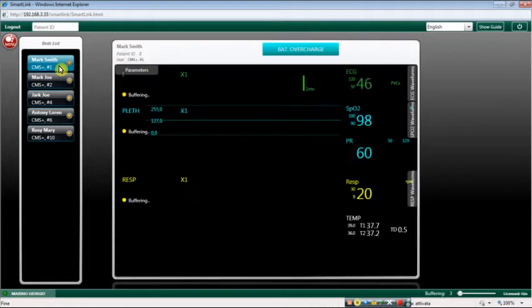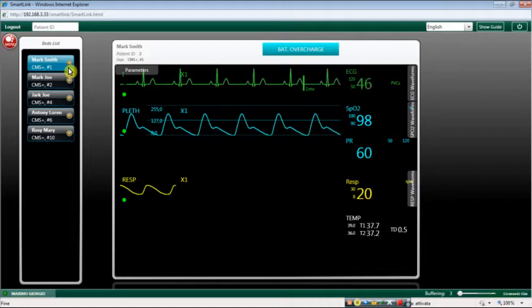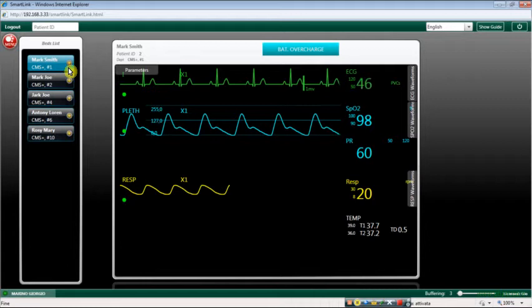The colour of the radio button inside the bed button shows the highest alarm level of the corresponding patient monitor. Green means no alarm while yellow is for a low-level alarm and red for a high-level alarm.